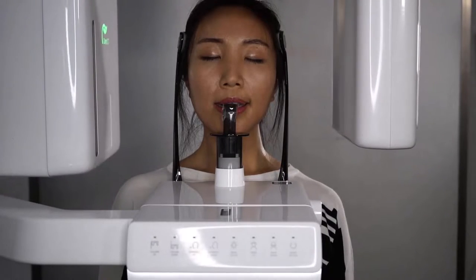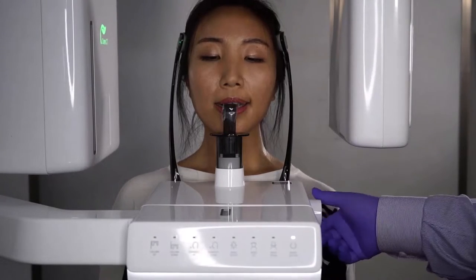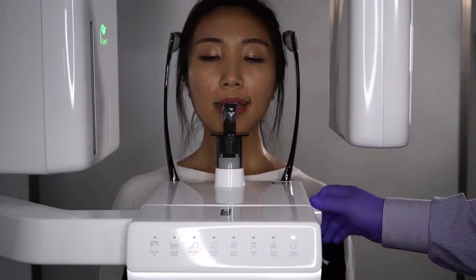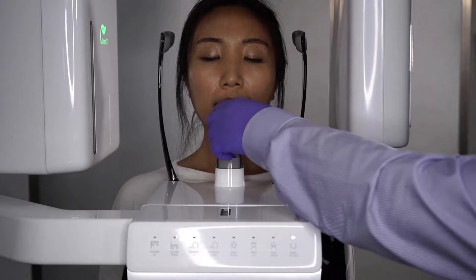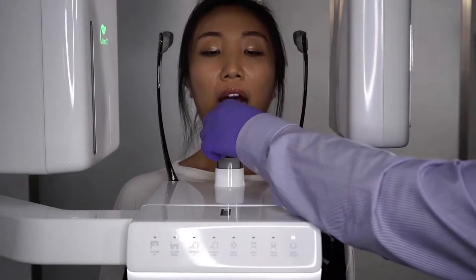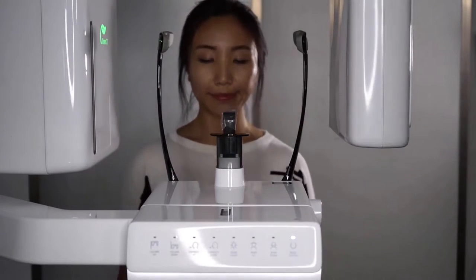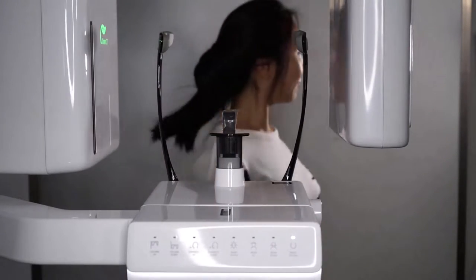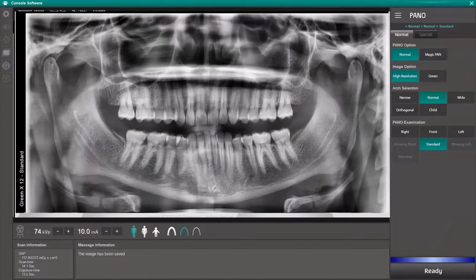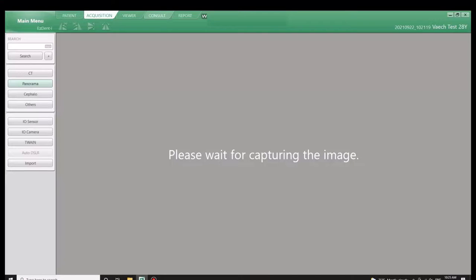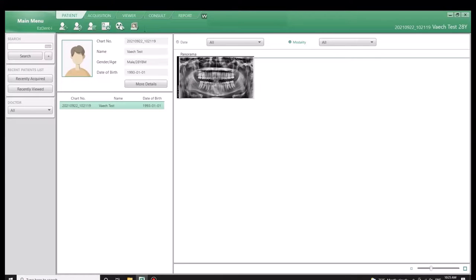Once image acquisition is complete, turn the temple rod adjustment counterclockwise and release the patient. The image is then saved directly to the patient's chart for review.